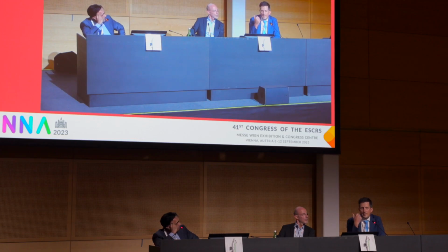So as I showed you, the results for the subjective question for nighttime driving were a bit less in the EDOF group as compared to the monofocal. We will rejudge that when we have the full data set. So maybe we need to look deeper into that question. But yes, definitely, especially when you drive at night, and also there are a lot of professional drivers who have to drive at night. In these patients, we need to be cautious, of course.